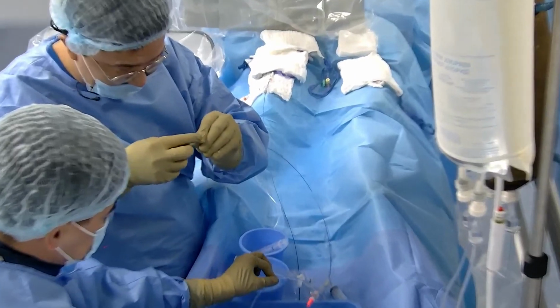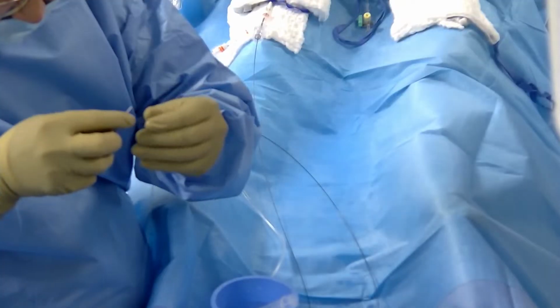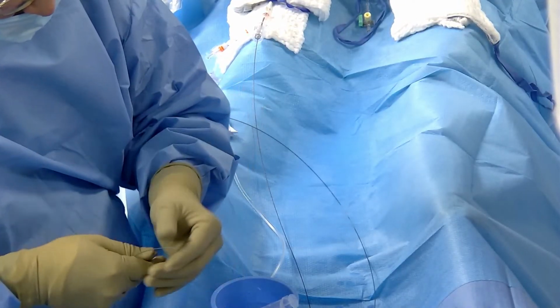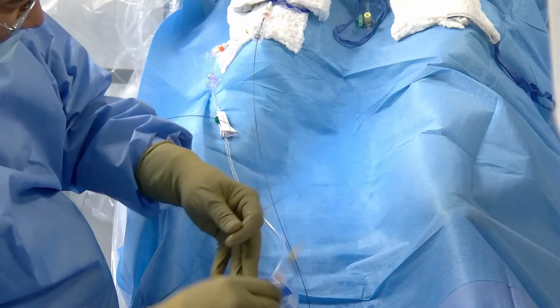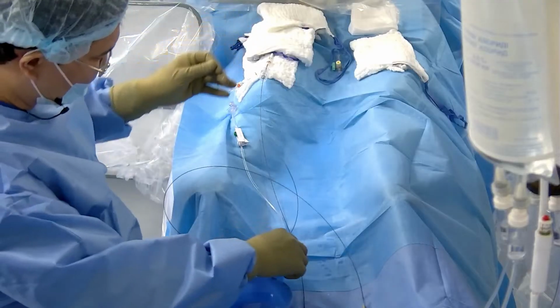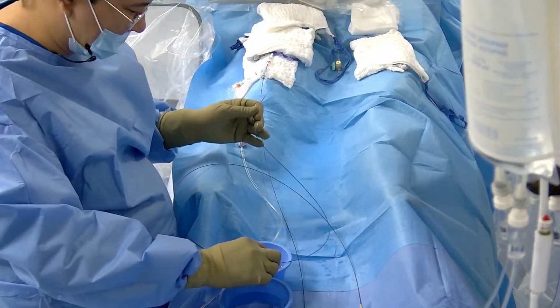I have seen those complications, and one of my first uses of the Scepter balloon was related to this mispreparation.